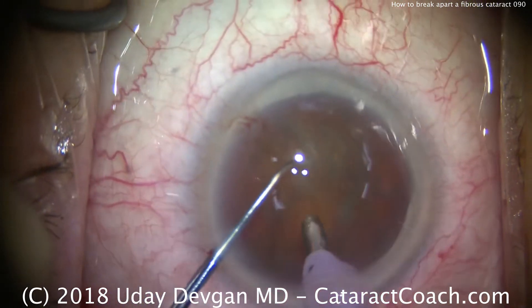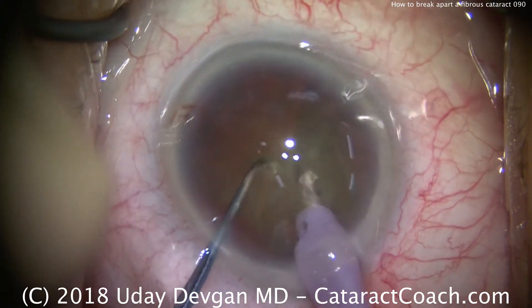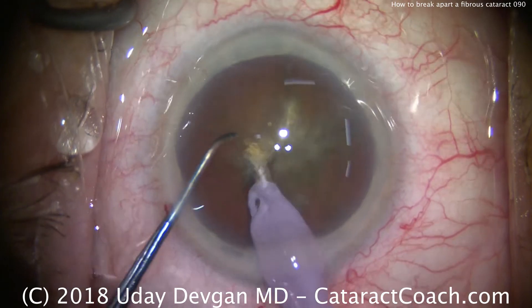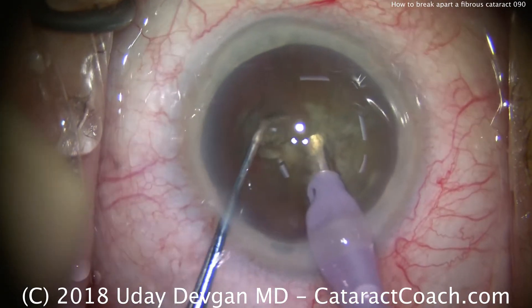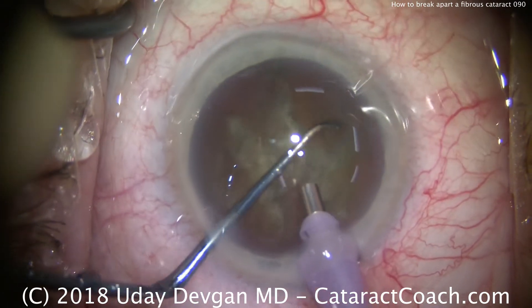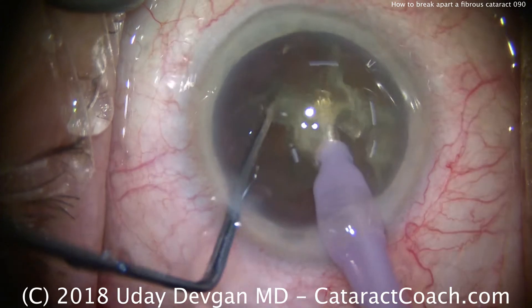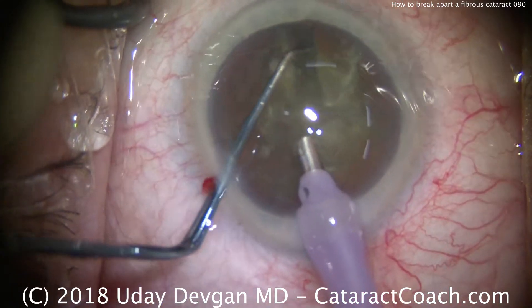Buzz in with the phaco probe, place the chopper, and it just doesn't chop. So a little bit of a chop there. Rotate the nucleus, try again — buzz in, pass the chopper, go around the equator if needed. That's a little better, but it's still not really a chop. Rotate again, buzz in again, advance the chopper, bring the two together. There's finally a little bit of a chop, but it didn't propagate fully through the nucleus.